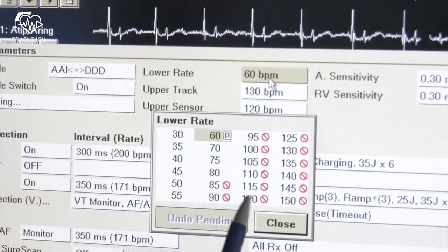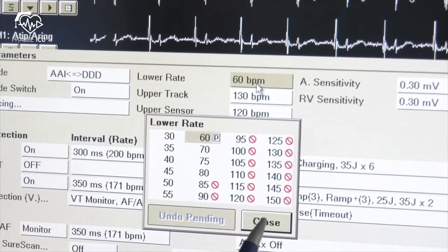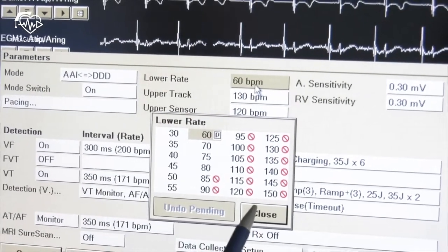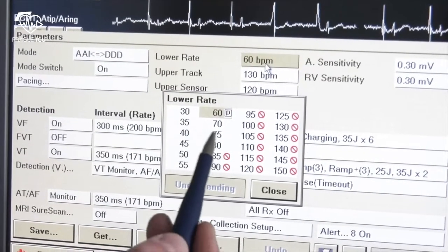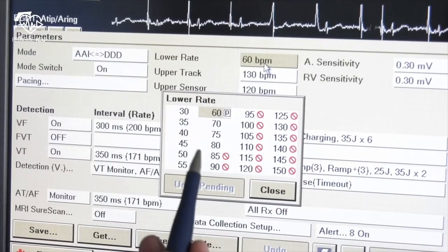In the lower rate section you can set pacing rate between 30 to 150 beats per minute. Lower programmed rate is the rate at which a pacemaker will pace the heart in the absence of intrinsic cardiac activity. Nominally it is set at 60 beats per minute. In rates of 85 beats per minute and higher there is a crossed circle symbol, meaning you cannot set this rate because of conflict with other set functions of the device.